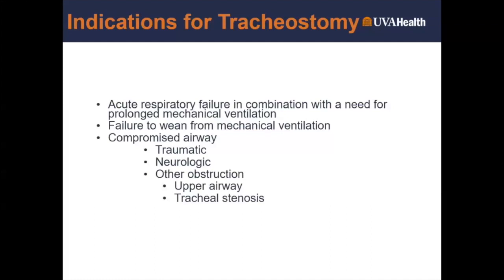So she had a ton of damage, a bunch of Lefort fractures to her face, in addition to other bony damage to other structures. So she was lucky we didn't have to emergently crike her, and under fiber optic scope, they actually trached her and all that stuff.